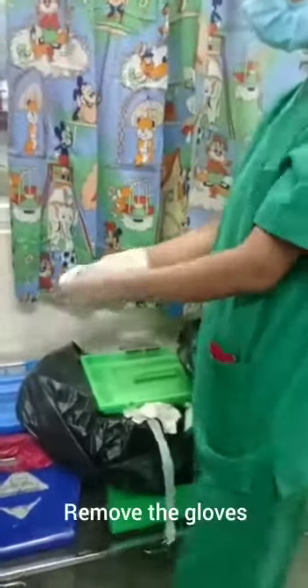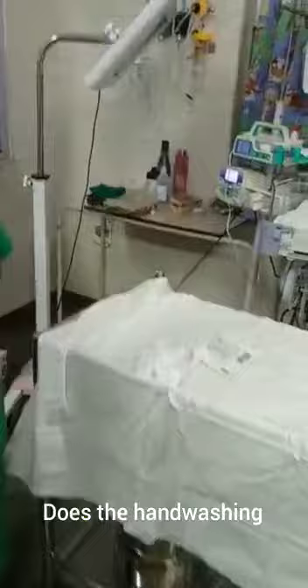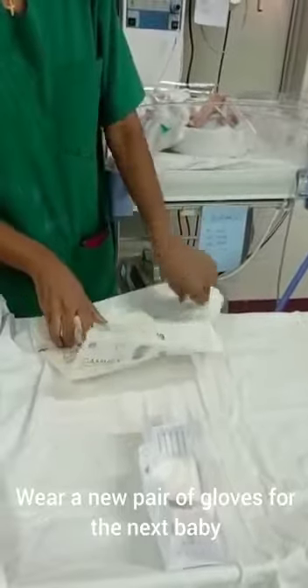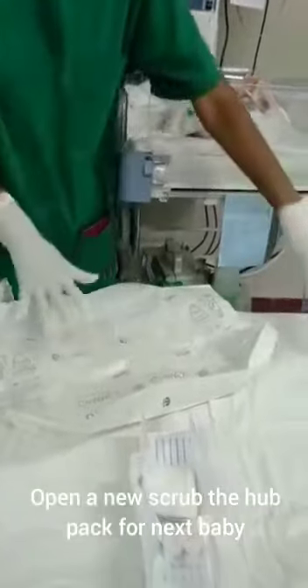The nurse removes her gloves and performs hand washing. She then wears a new pair of gloves for the next baby and opens a new scrub the hub pack for the next baby.